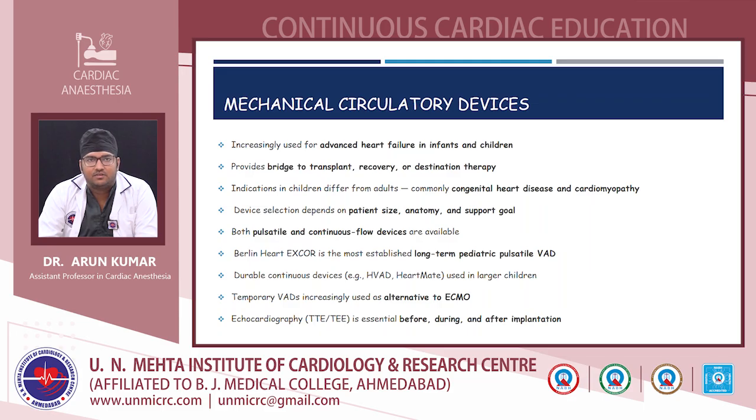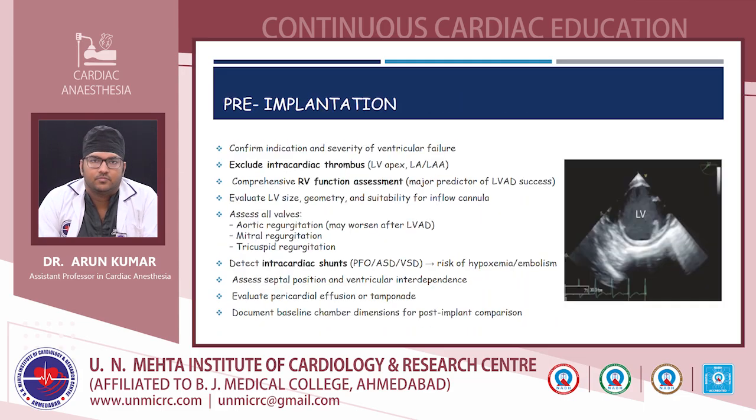Berlin Heart EXCOR is the most established long-term pediatric pulsatile ventricular assist device. Durable continuous devices, HVAD and HeartMate, can be used in larger children. Temporary VADs are increasingly used as an alternative to ECMO. TE is essential before, during, and after implantation. The role of TE in the pre-implantation period is to confirm the indication and severity of ventricular failure, and to exclude intracardiac thrombus. There are areas which predispose to intracardiac thrombus, which are the LV apex, left atrium, and left atrial appendage.